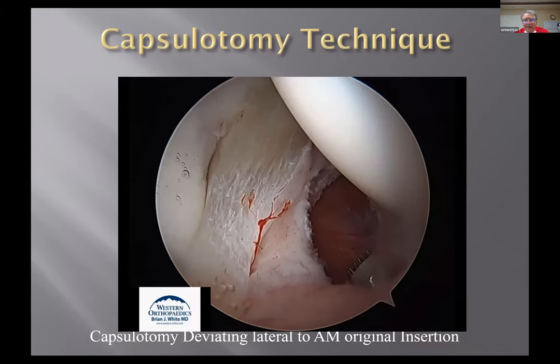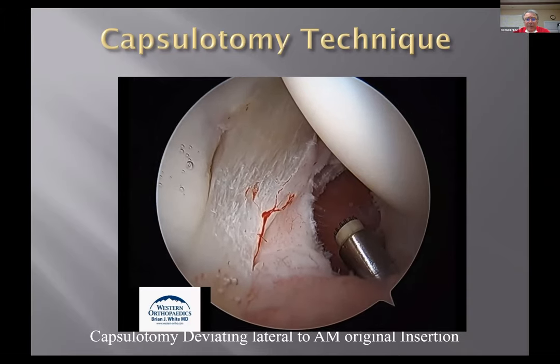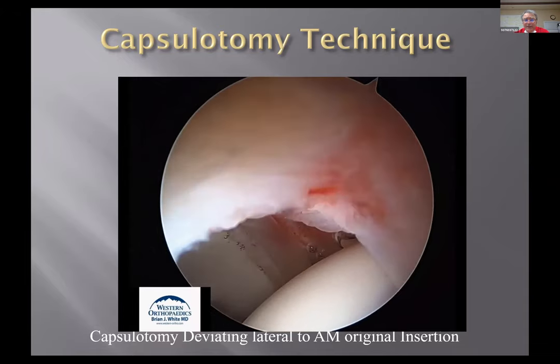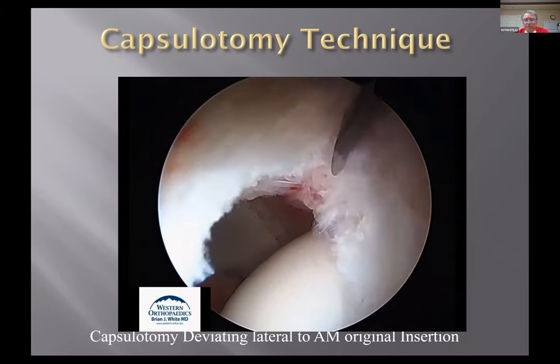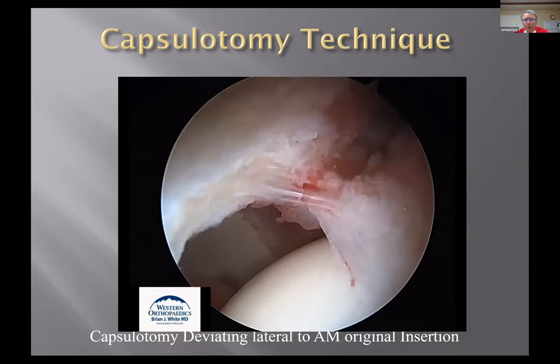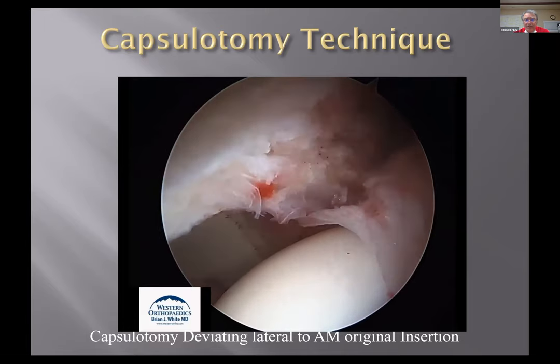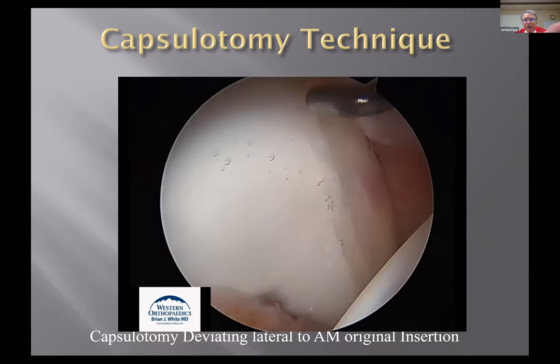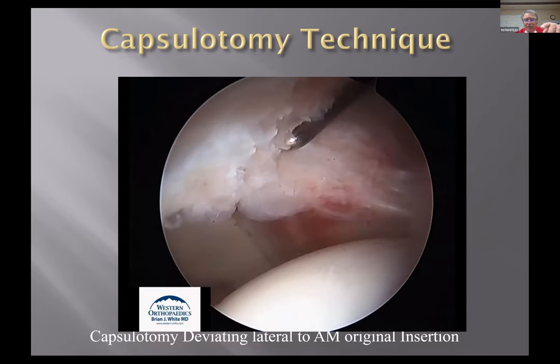This is Brian White's technique, and Brian likes to use the beaver blades, but you can seal some of the bleeders as you go, and you can actually improve your capsulotomy by coming outside the capsule and then getting more exposure to your femoroplasty and then some of your access to the peripheral compartment. So we're going to go through a little bit of what we do with the exposure in the capsulotomy, but again, the key is to be able to get in, get around and see your acetabulum, look at your labral structures, make sure you can get to the peripheral compartment.